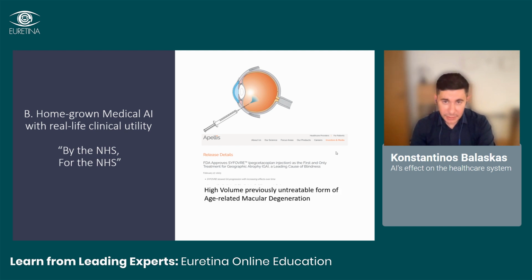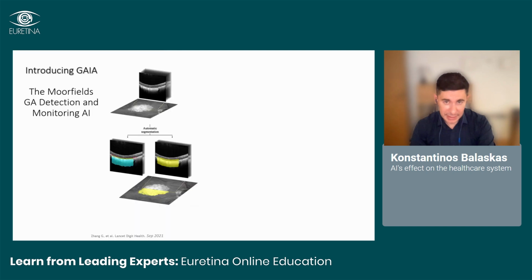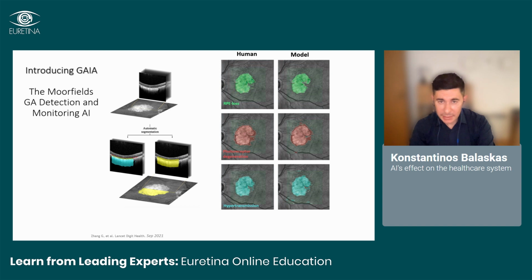For geographic atrophy, this is going to be particularly challenging because it's a slowly progressing disease, and then quantification, accurate quantification and monitoring will be essential. So we developed the Gaia app, the Gaia AI model, which means Geographic Atrophy Intelligent Analytics.